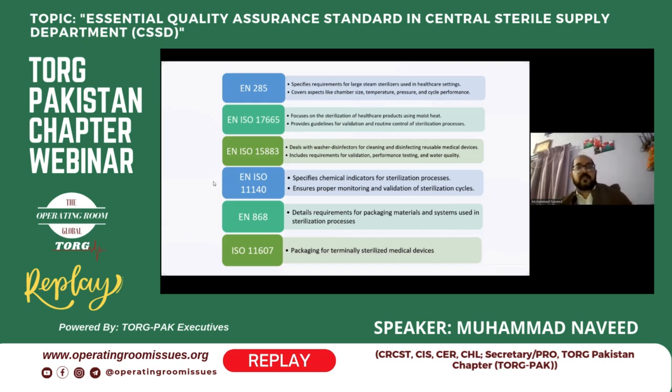EN ISO 11140 specifies chemical indicators for sterilization processes. We are using so many indicators in our CSSD.